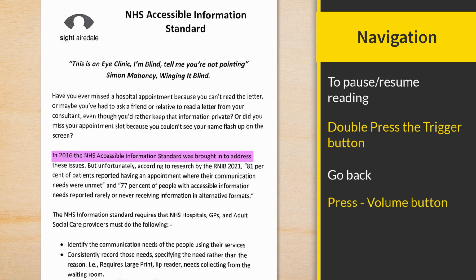Let's say I want to go back and have her repeat what she just read. So to do that, I can press the minus button.